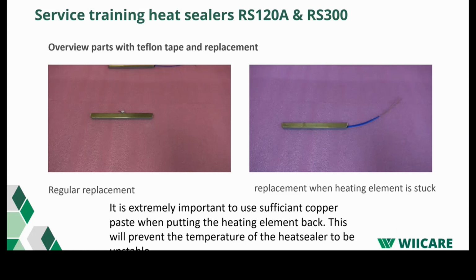When you put the heating elements back in the heating bar, it's extremely important to cover them with enough copper paste. If you would not put copper paste on the heating elements and put them back in the bars, you could see that the temperature reacts very slowly. So if, for example, you set the temperature to 180, it could reach the 180 quite slowly, then you have a slight overshoot, and then it drops again. And that's just because you would not have enough transfer of the heat to the brass bar. So that's why the copper paste is very important.